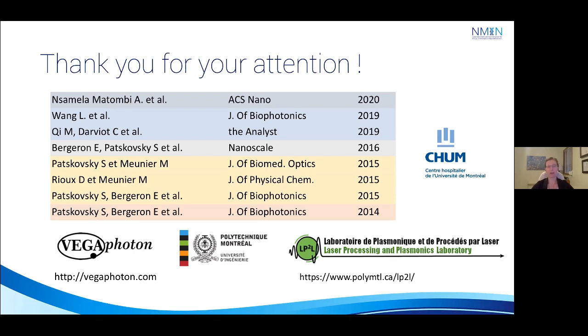Cécile, could you speak more about how multiplexing at the single cell level would be an improvement compared to current procedures? Yeah, sure. Thank you for the question. As I explained before, most of the time pathologists now can do multiplexing, but only on several slides. And because in cytopathology the structure of the tissue is lost, we cannot ensure that we are looking at the same type of cell from one slide to the other.